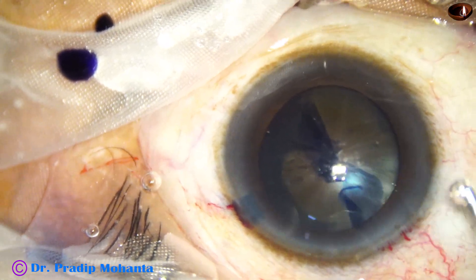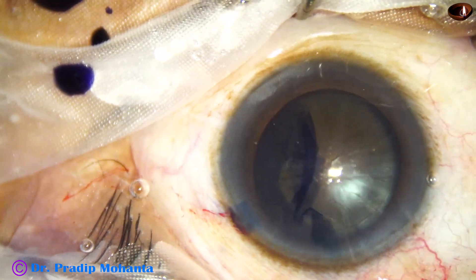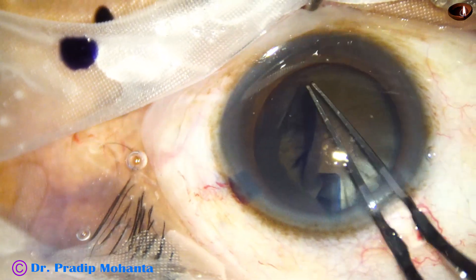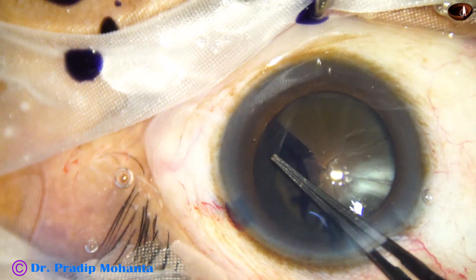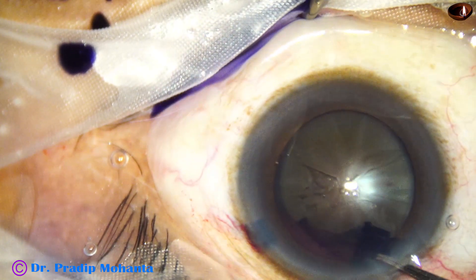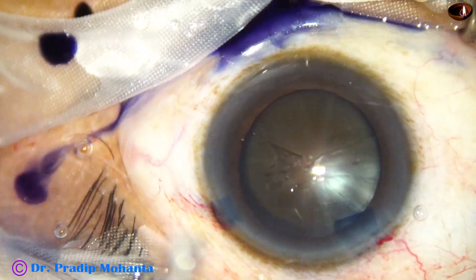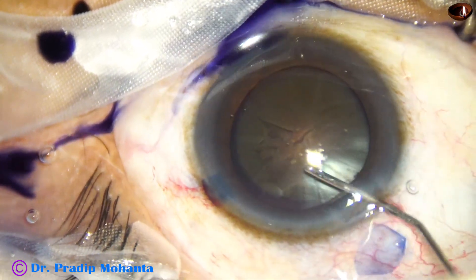The anterior chamber has become shallow, so at this time I inject some more viscoelastic, take the utrata again, and complete the rhexis. Done. So we have done an adequate sized capsulorrhexis.